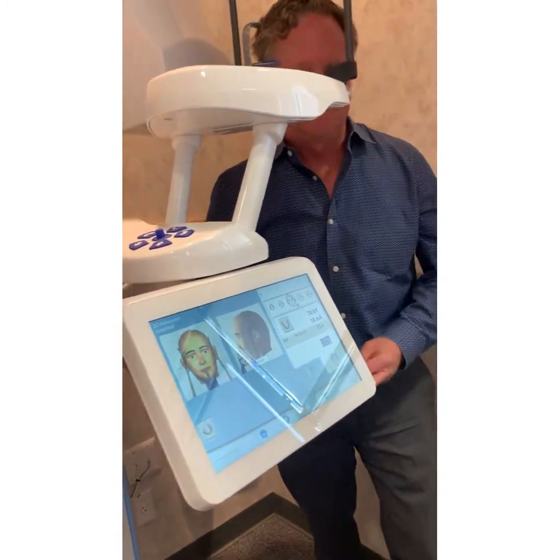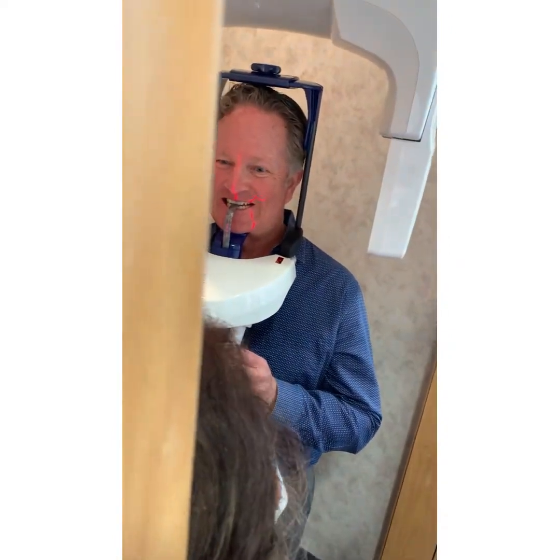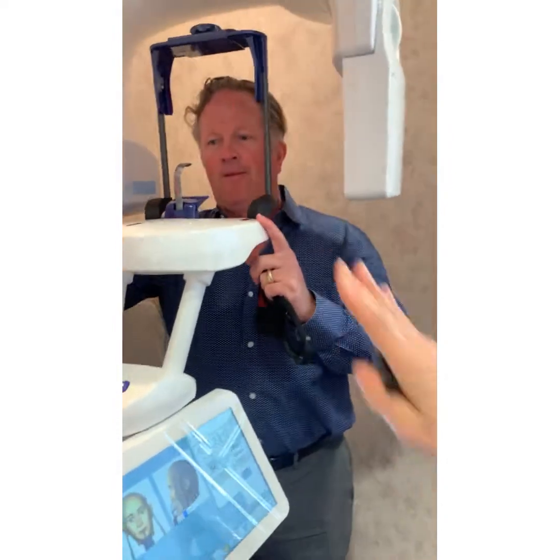See, and that's my concern. Because before, the way the panel was, I could go to the front and see how they look. Now I have to kind of go to the side. Yep, you're perfectly fine. Because some of the elderly people, I keep an eye on. You just want to palpate their head, make sure they're straight in the machine. Yeah. But now I'm doing that at an angle.